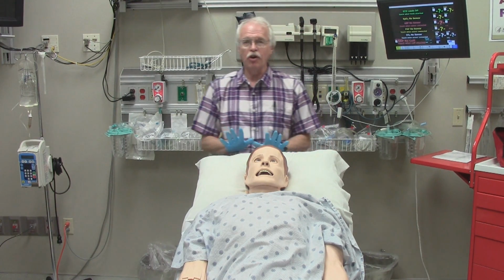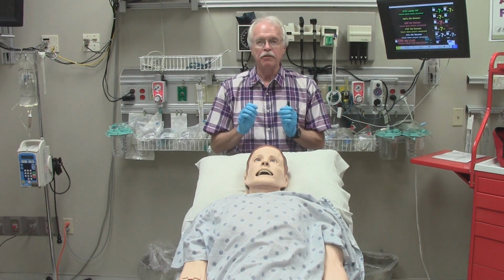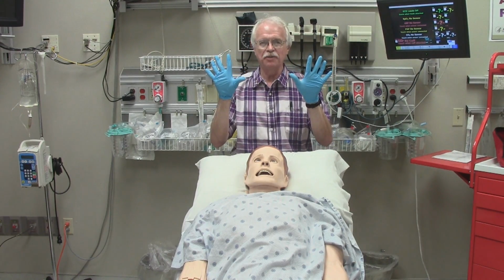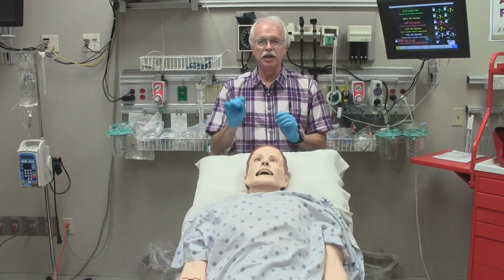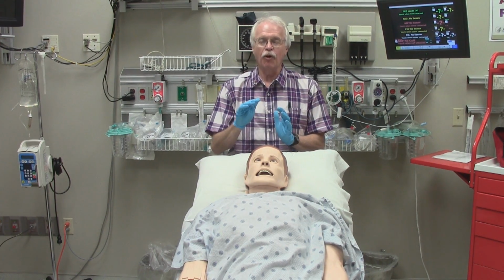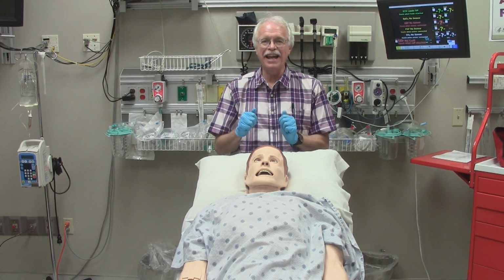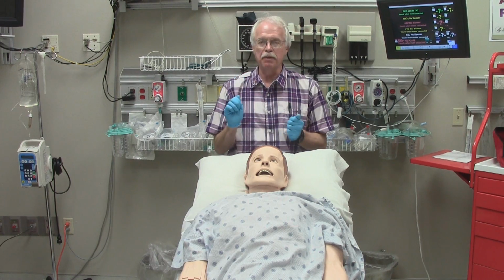To begin with, we'll talk about how to work safely with SimMan Essential. First, when you work with any of our simulators, please wear gloves. That is primarily to protect our mannequins. If you touch the mannequin with your bare hand over time, skin oil will transfer onto the mannequin's surface and stain the plastic a yellowish brown color. That's why old Resusci Annie mannequins always have that yellowish brown stain in the center of their chest. That's skin oil from people's hands.